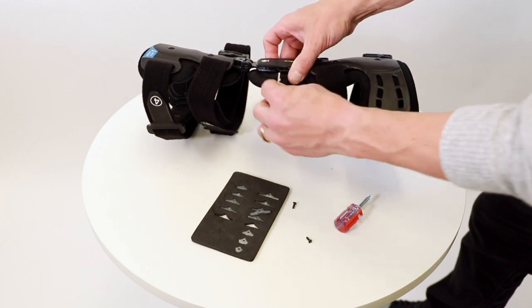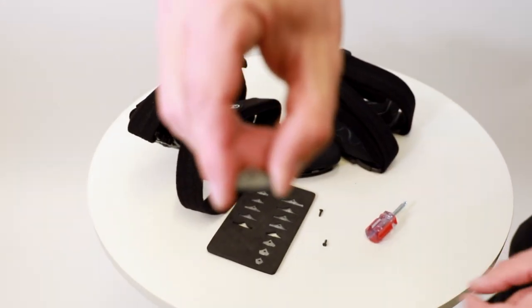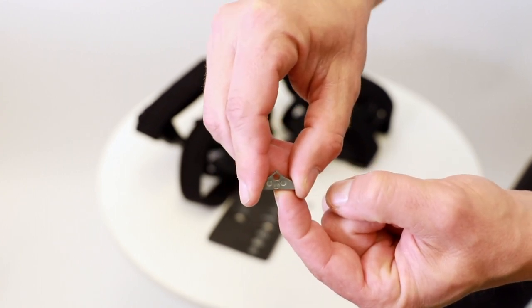Flexion stops can be inserted on one side of the hinge, while extension stops fit into the other side. Once your physician determines the degree of flexion or extension needed, locate the proper stop by looking for the degree printed on the face of the metal.